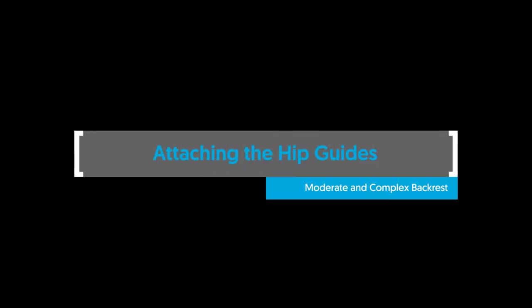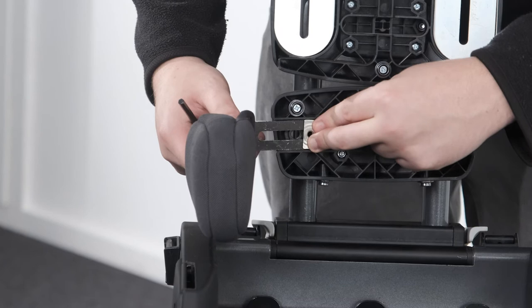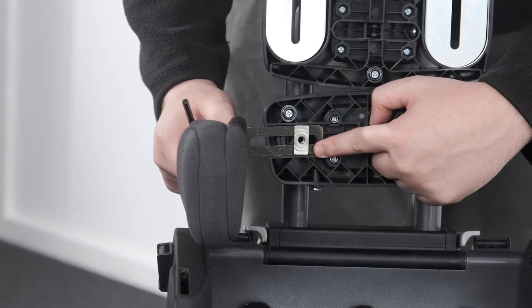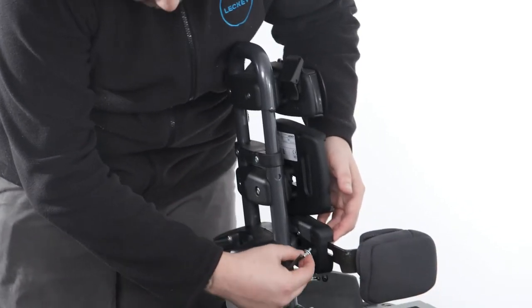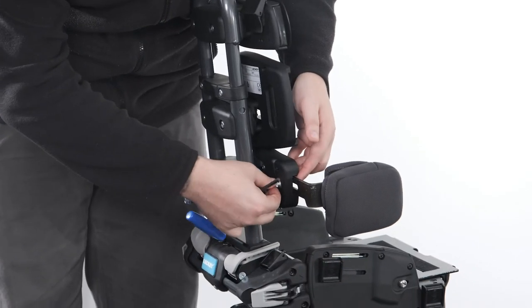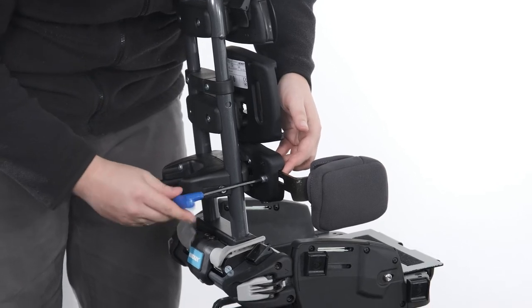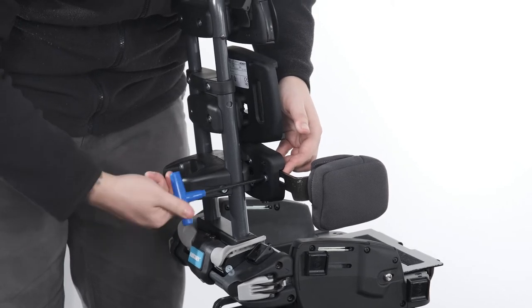Attaching the hip guides — moderate and complex backrest. To attach the hip guides to the moderate and complex backrest, place the T-nut into the slot at the front of the hip guide bracket. Place the bracket into the recess in the front of the sacral moulding, ensuring the short edges of the T-nut are in line with the top and bottom surfaces of the recess. Place the split washer then the plane washer onto the bolt and pass it through the hole at the back of the sacral moulding, engaging the threads of the T-nut. Secure in place with the Allen key.